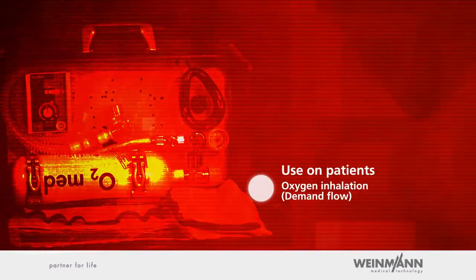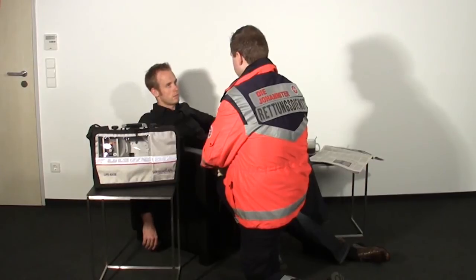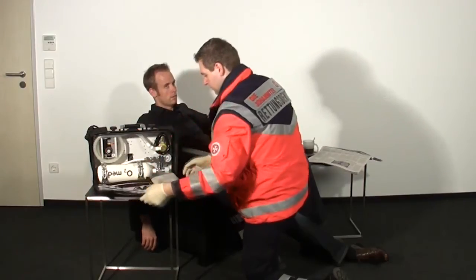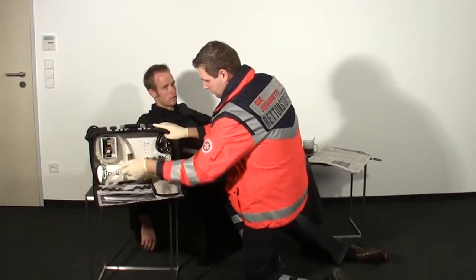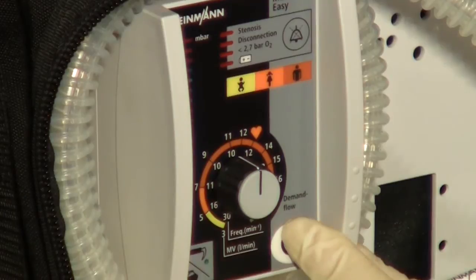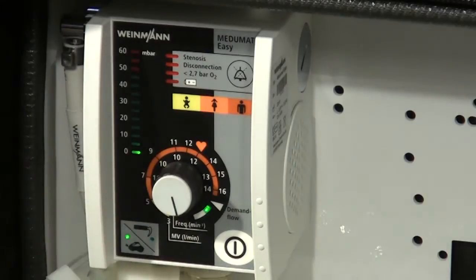Use on patients — Oxygen inhalation, Demand flow. In case of a conscious and spontaneously breathing patient, Mejumat Easy can be used for economical oxygen inhalation. First, open the oxygen cylinder. Switch on Mejumat Easy by pushing the ON-OFF switch to ON. Pay attention to the voice prompts. To activate the demand flow inhalation function, turn the regulator knob beyond the stop-notch into the demand flow range.